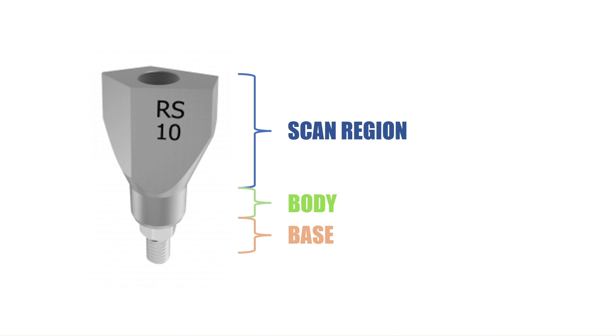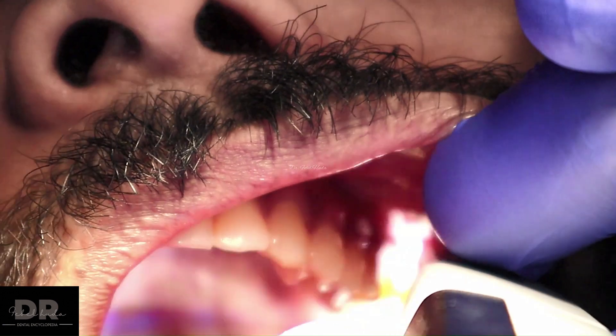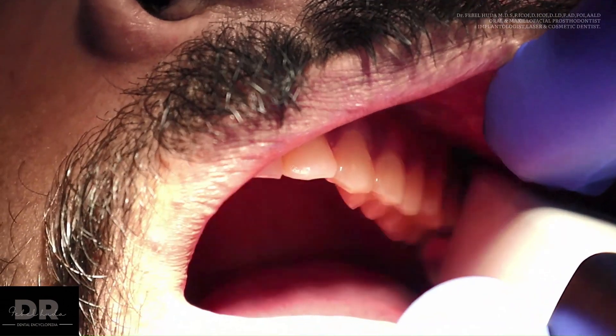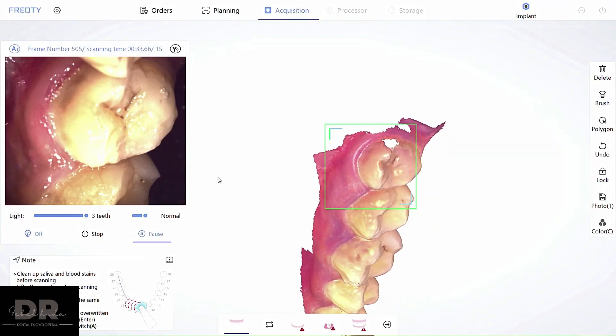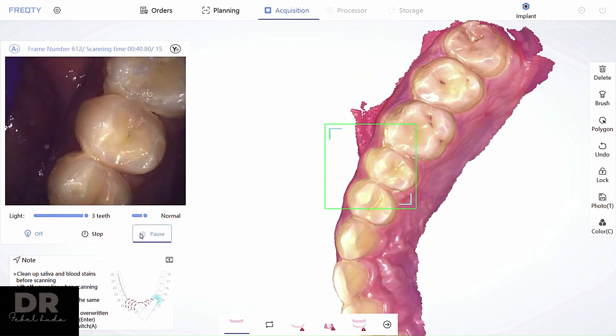We're going to start off by recording or scanning the opposing quadrant. Since it's a single implant, we are not going to scan the entire arch — only the quadrant. The maxillary quadrant is being scanned first, and then we move to the quadrant onto which the implant has been placed.